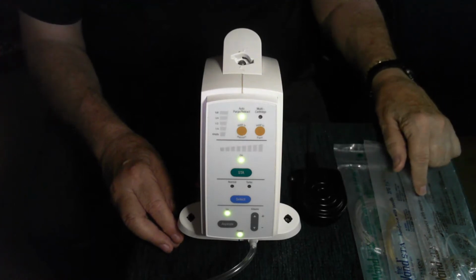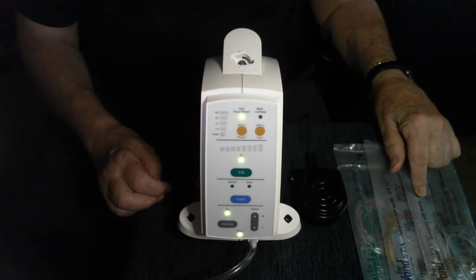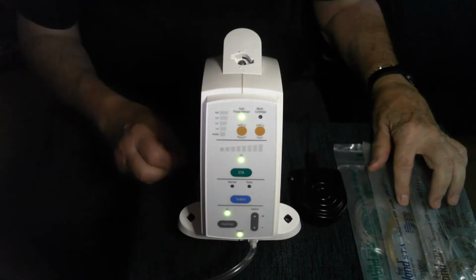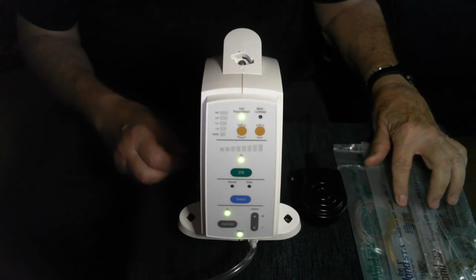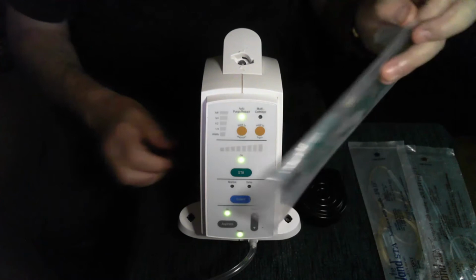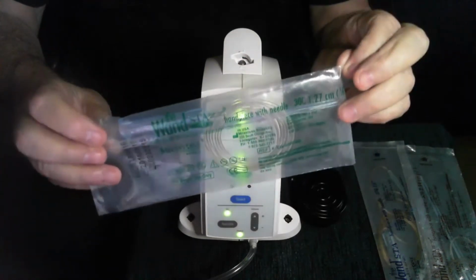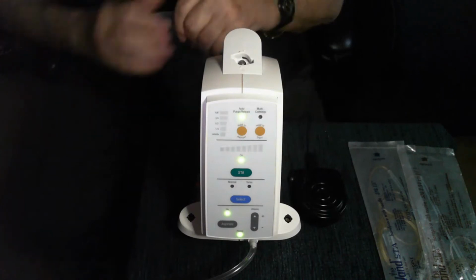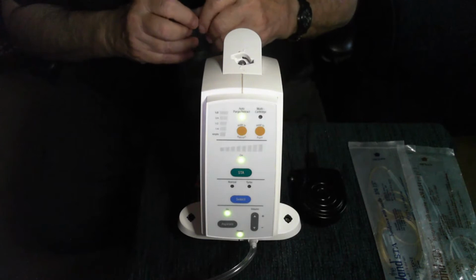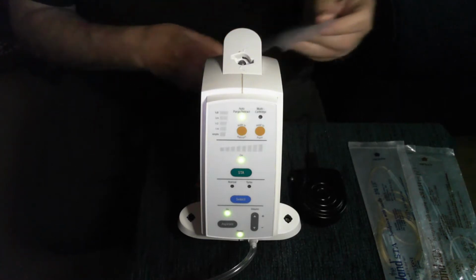The brown one is the one you're probably using now for infiltrations. It's a 30 gauge 1-inch needle. The blue one is the 27 gauge 1.25-inch needle, which is used for the mandibular block. And we typically use the green one most of the time. The green is a 30 gauge 1/2-inch needle. And this is what we use for the interligamentary injection, the single tooth injection. And we use it for all the palatal injections that I'm going to show you.